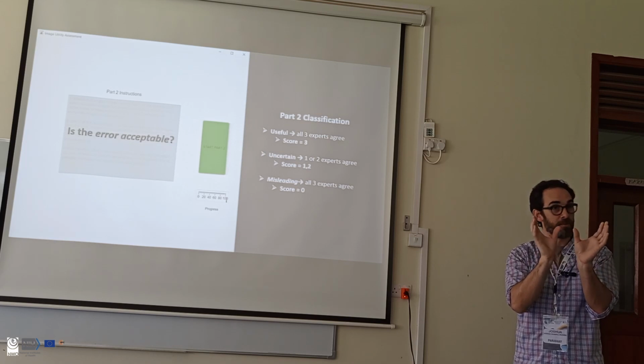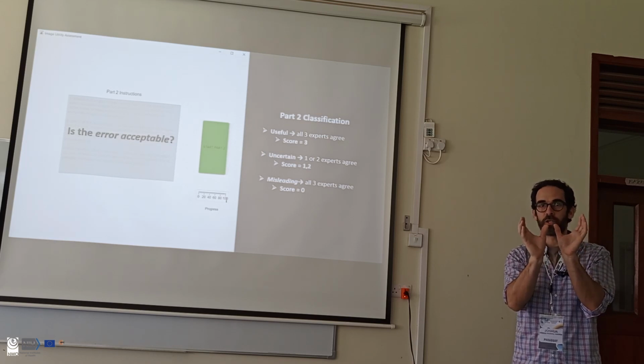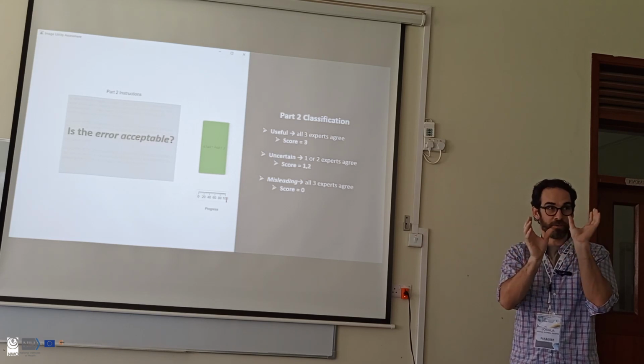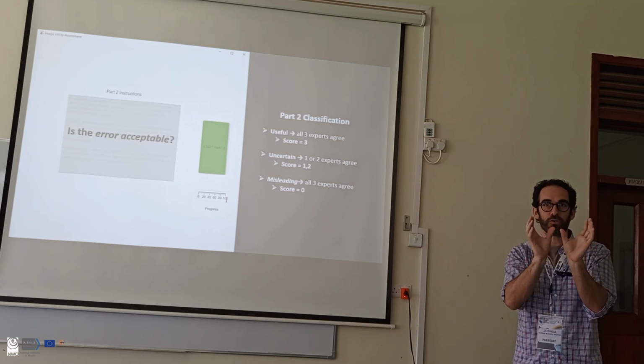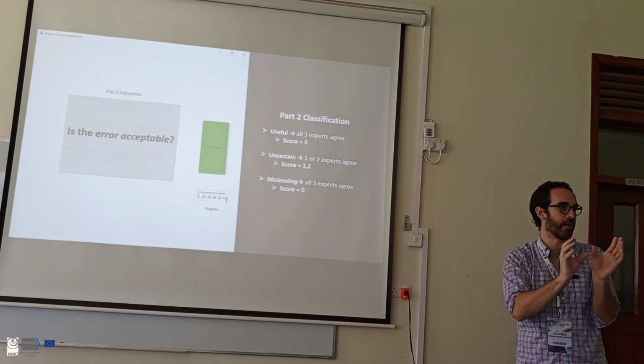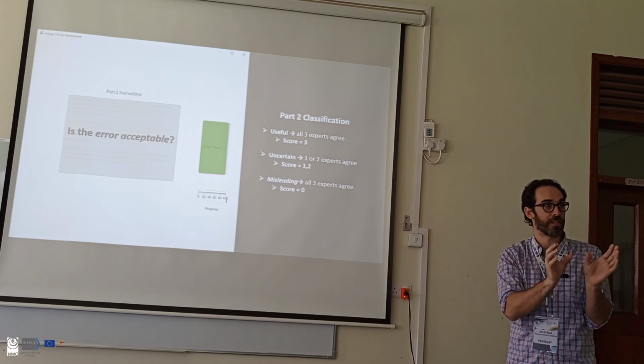And I asked them, you see that there are errors between the machine learned image that you said was great, you guys loved it, and now you see the ground truth version. Are the errors that you see acceptable to you? And they were able to revise their scoring of that machine learning image based on seeing the ground truth.